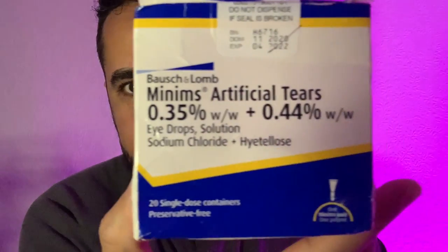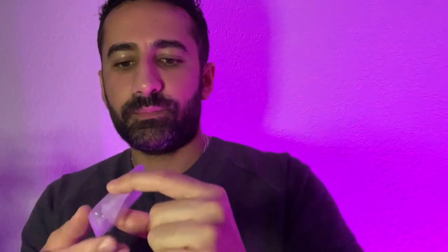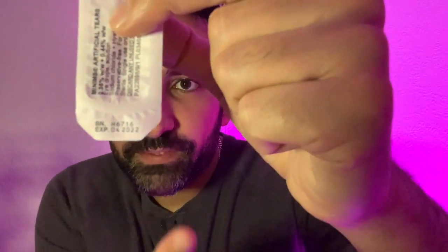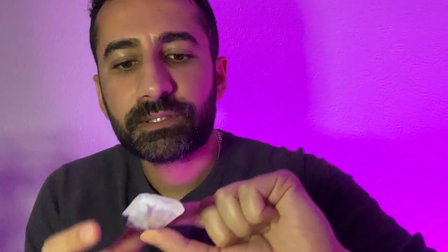A box of 20 minims for your patient to try. Within the box you shall find 20 of these — your minims with a protective plastic instiller. Just to be sure, check your expiry date and batch number; it's very important that you check those and confirm what the product is before you place anything inside your patient's eye.